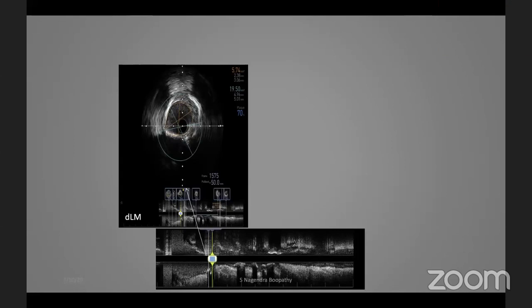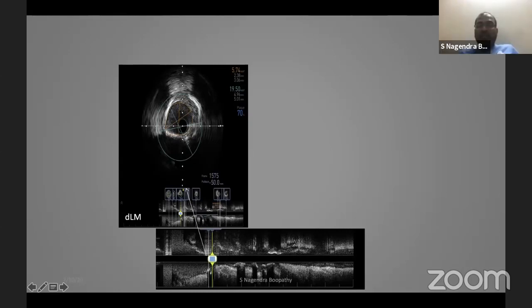There's a practical problem, particularly when the image is bad or you are reusing the IVUS catheter. Often I see even experienced operators, even in live cases, just draw one line and say that is the outer line, and the audience should believe it. They may be right out of experience, but the audience is left to think about the imaging element.